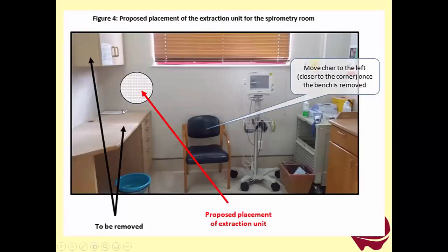So these are the ones that need to be removed. Please insert an extractor fan on that side, move the patient to this side, and then the supply is at the side of the healthcare worker, and that would blow away from the healthcare worker and then suck everything out. And you can even put in a screen or something else if you want to do that.